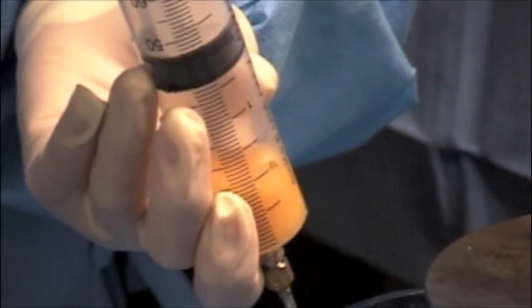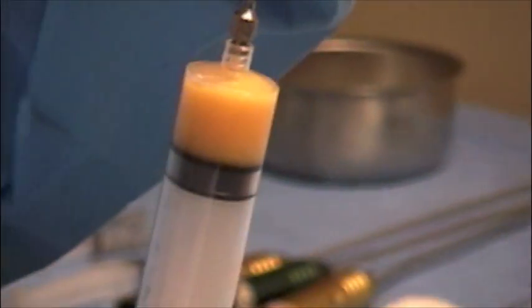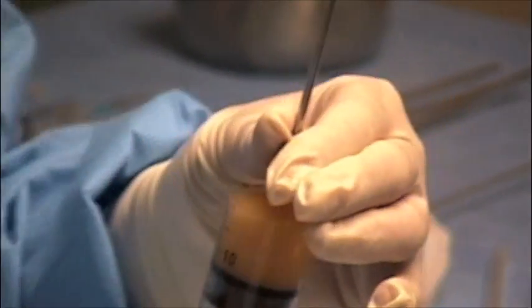Michelle, you just want to turn that up and show everybody what it looks like? Okay, so that will be used to transfer to his face. And now Michelle will transfer that fat to smaller syringes that we'll use for injection.